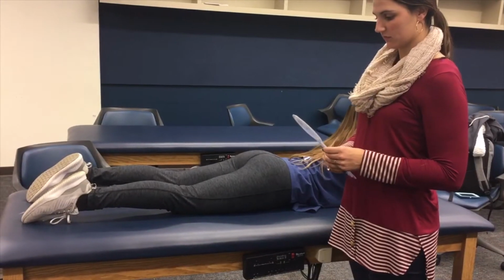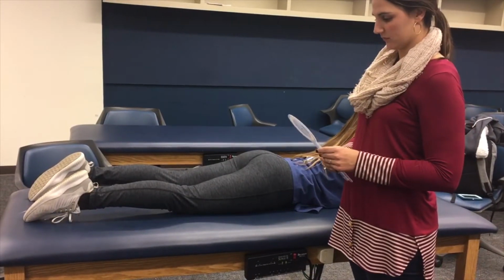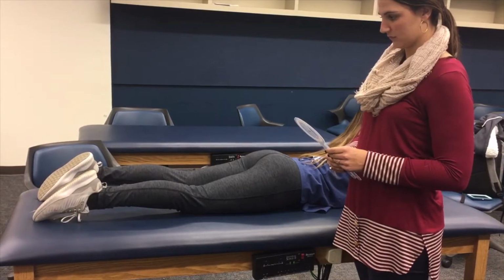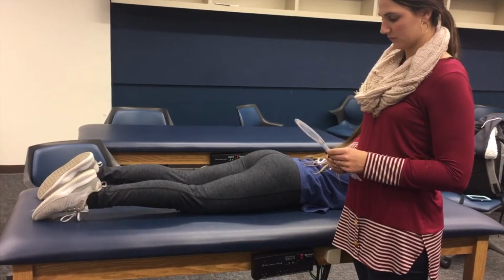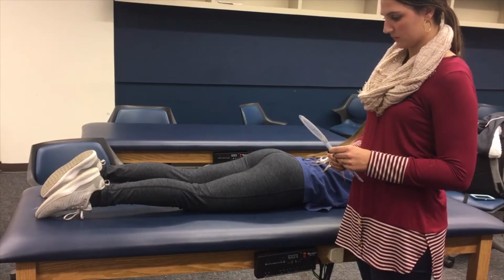Goniometry of the knee. Normal measurement ranges from 0 to 135 degrees. The position of the client is prone, though this can also be performed in supine. Knees and hips extended and hip in 0-degree neutral rotation. The position of the goniometer.